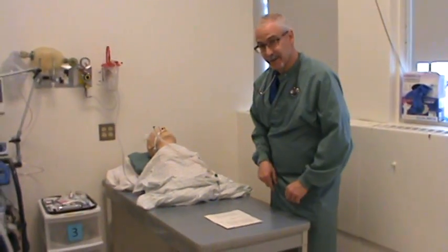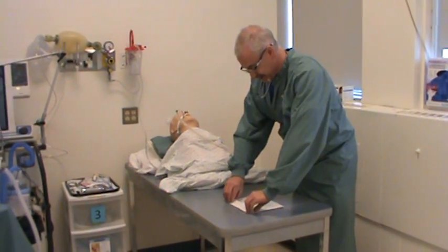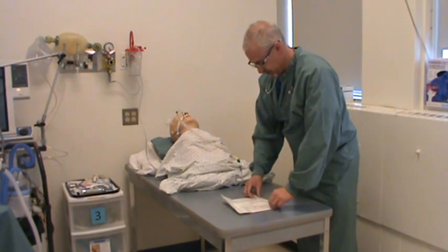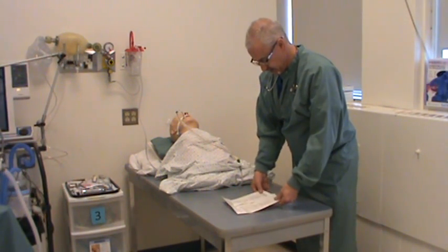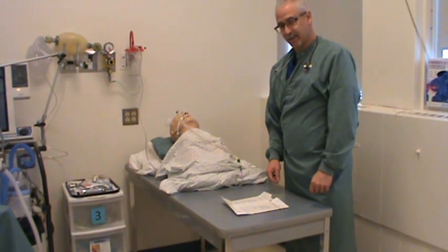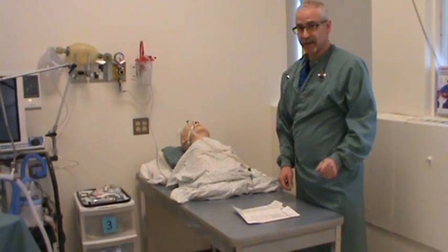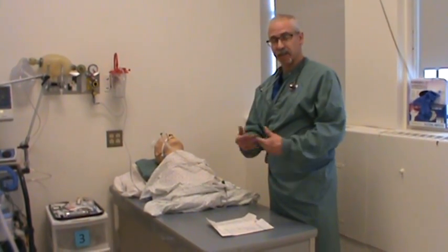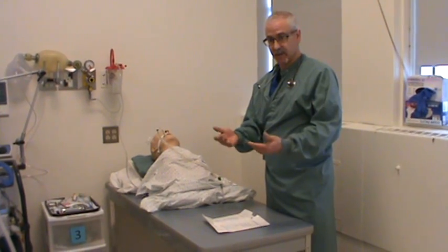I've got a band-aid on my finger here, and I hope it's not going to impede my movement or the putting on of the sterile gloves. It also says to make sure my hands are dry before I put them on — thoroughly dry. That's a good thing, because if your hands are wet, it makes it more difficult to place these gloves on your fingers and onto your hands.